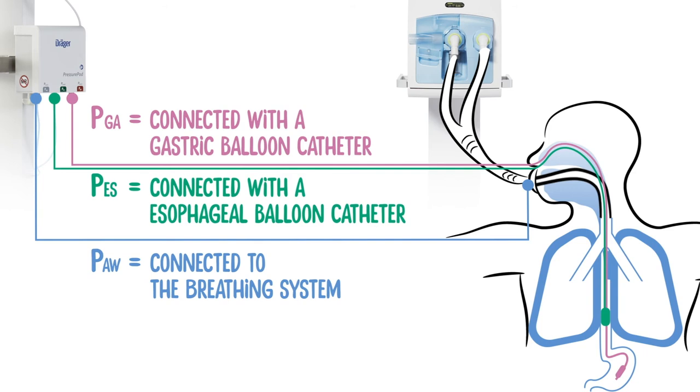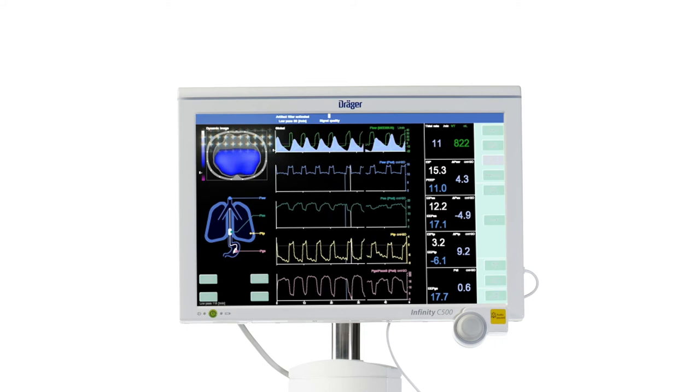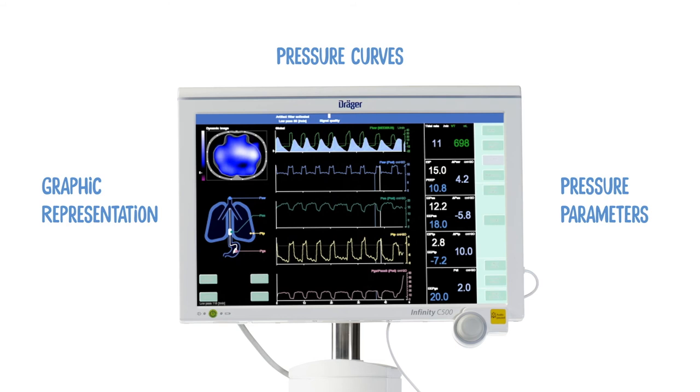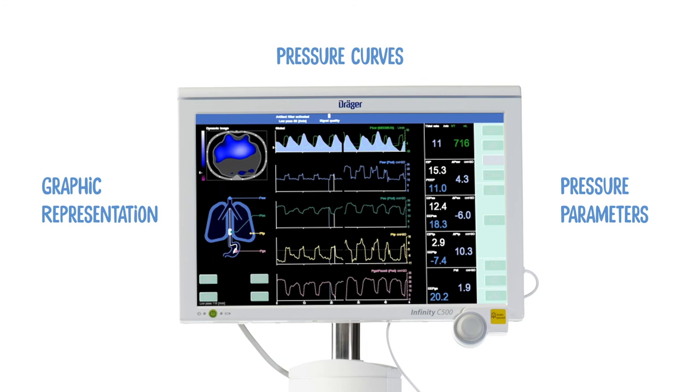In the new PTP analysis view of the Pulmo Vista you have the regional ventilation distribution displayed together with the pressure curves and parameters simultaneously in one view, complemented by several analyzing options.